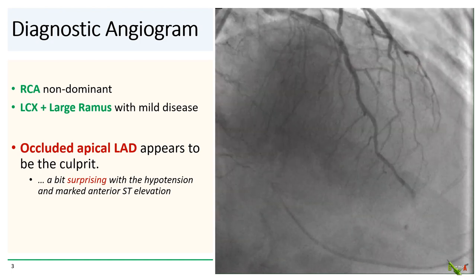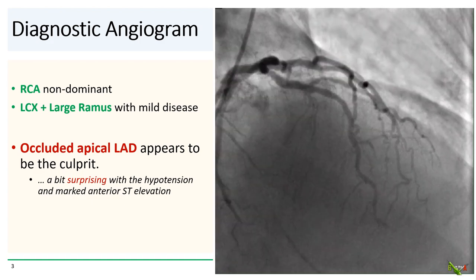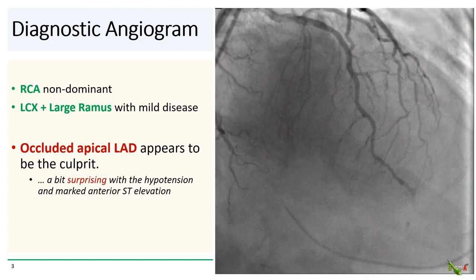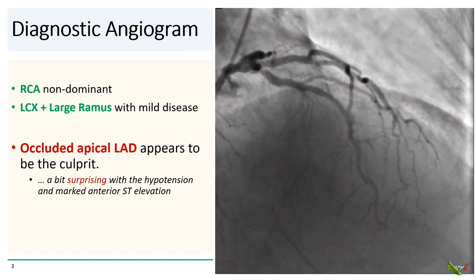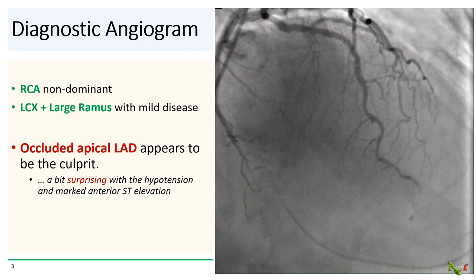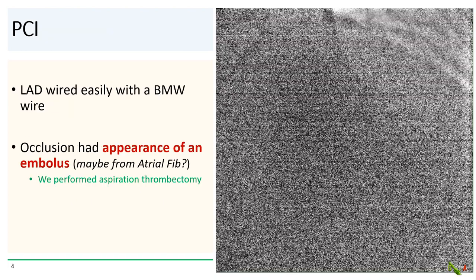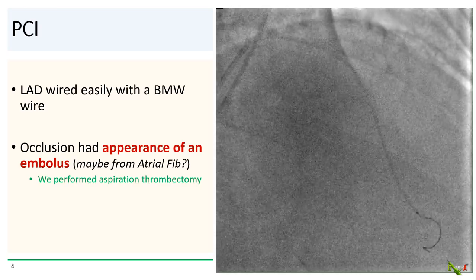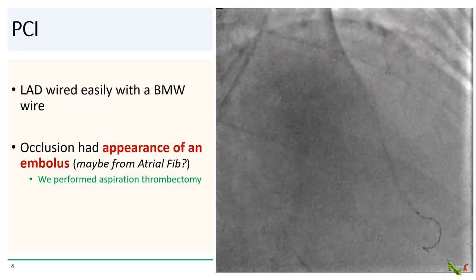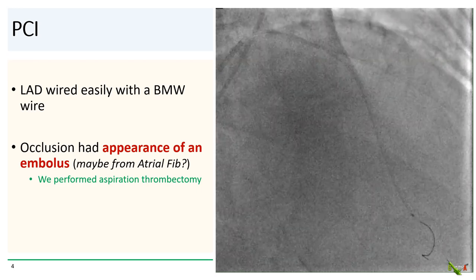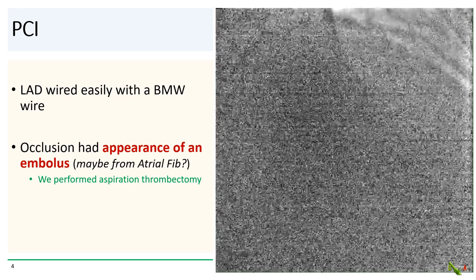On diagnostic angiogram, the RCA was non-dominant and the left circ and large ramus had only mild disease. The culprit seemed to be an occluded apical LAD. And frankly, this was a little surprising given the patient's presentation and marked anterior ST elevation.